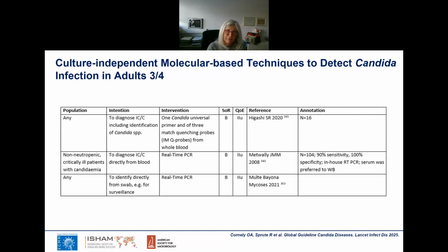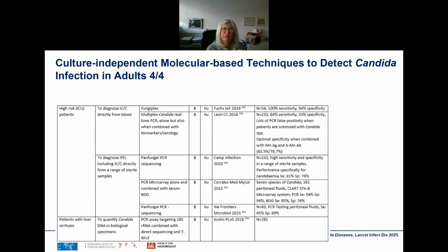So there are different methods, and the total turnaround time strongly depends on whether there is automation or not, what the DNA target source is, whether it's fungal cell or free DNA, or the need for sequencing or for outsourcing. And even the usage of the various extraction kits may influence the results.